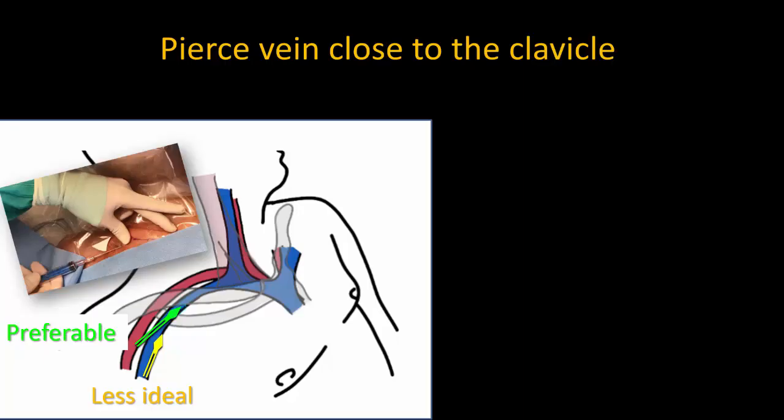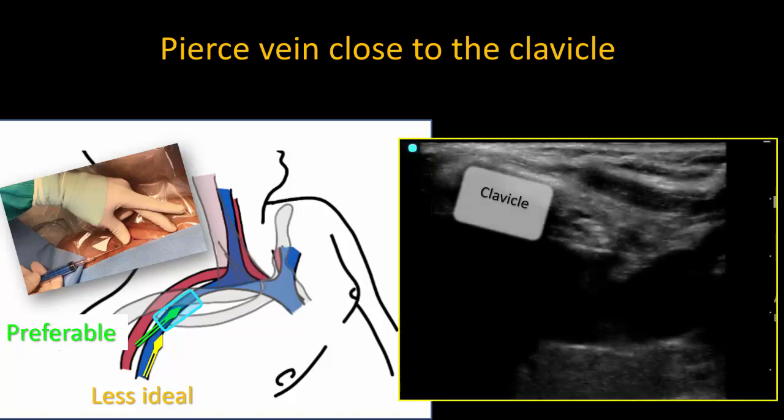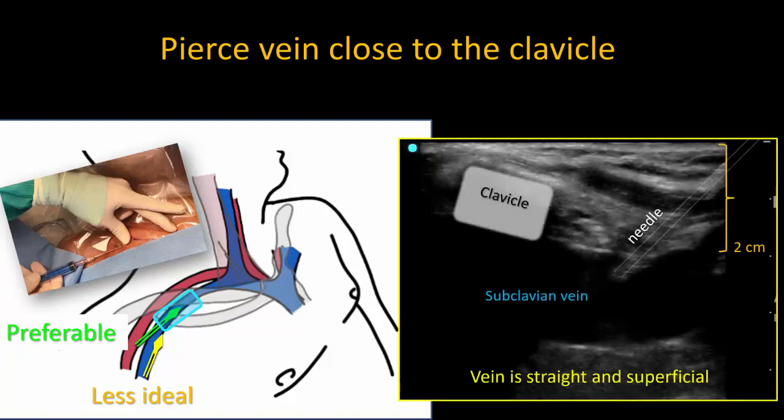I found that the key is to place the probe such that half of it is overlying the clavicle, realizing that we only need to see part of the vein on our screen — the part we're actually trying to pierce. It doesn't matter that half of the screen shows the bony dropout of the clavicle. With this view, we can insert the needle at the lateral edge of the probe and end up much closer to the clavicle than we would otherwise be.